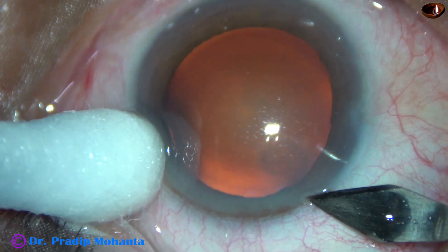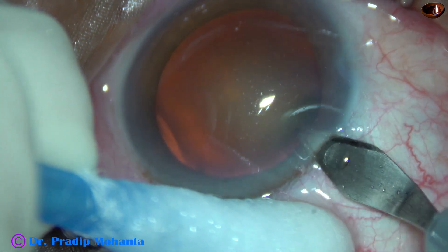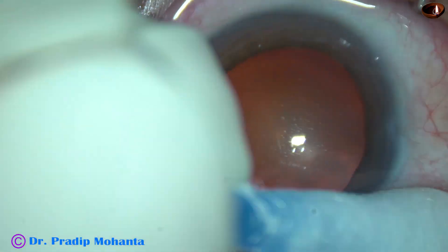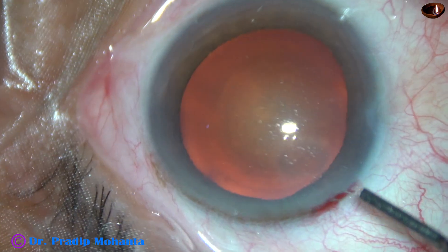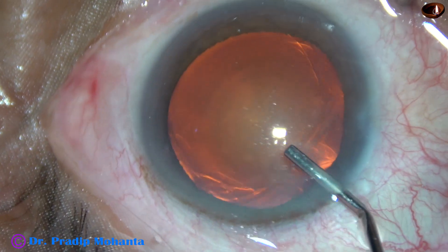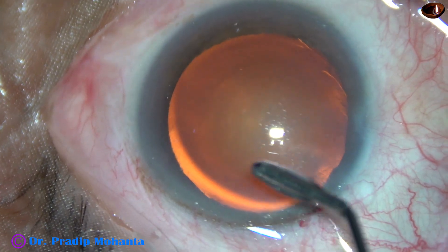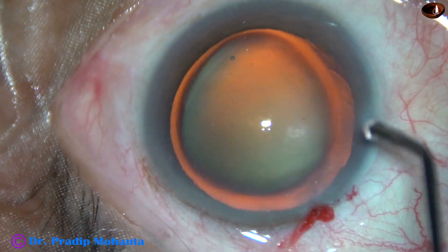This is the main incision with a 2.8 mm steel keratome. Now the anterior chamber is filled up with 2% hydroxypropyl methyl cellulose, and the methyl cellulose is applied over the corneal epithelium for better visibility.